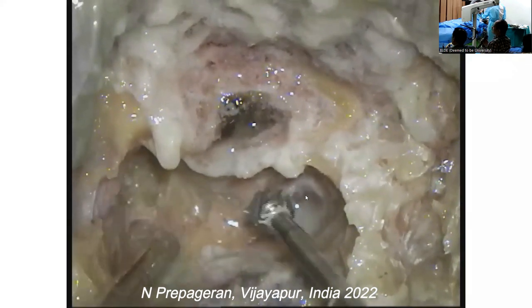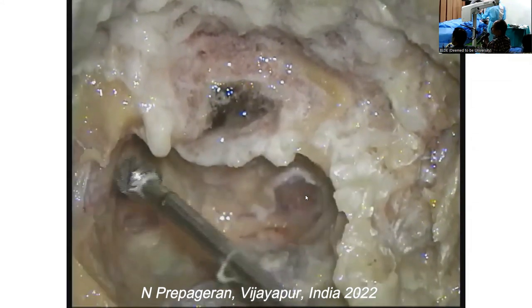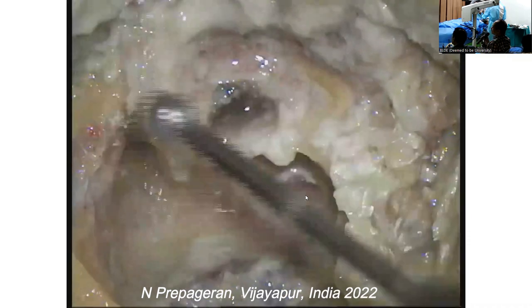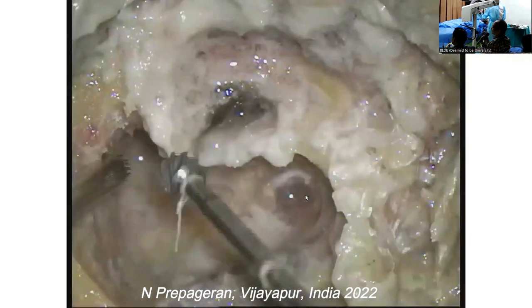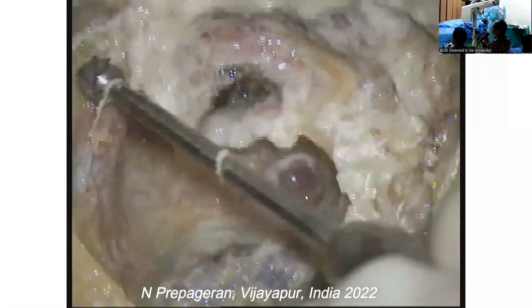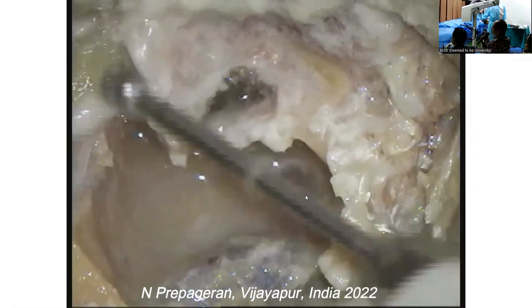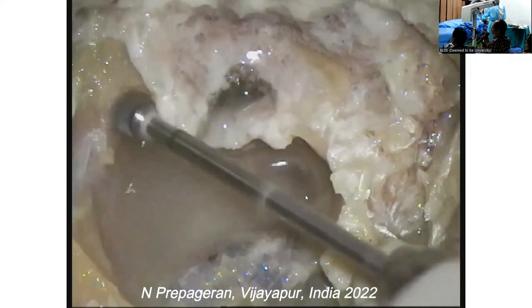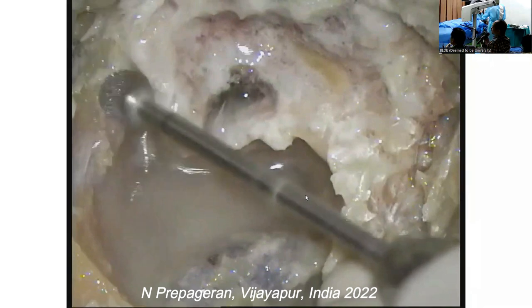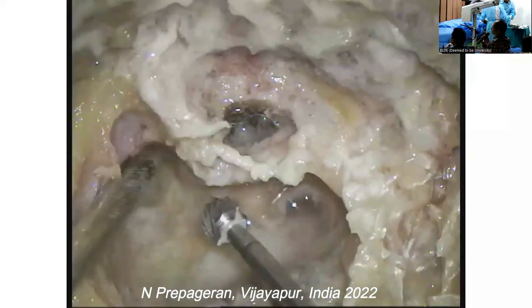Okay? During the middle cranial fossa approach, we have to go up to the anterior end of the root of the zygomatic. It depends on what you're doing it for. It depends on the exposure, whether you're doing it for schwannoma, or the tumor, your fifth nerve schwannoma, or the meningioma here, it all depends on the location. So, what I suggest is don't fix in your mind the approach. Let the pathology dictate your approach. Open as much and as little as required.